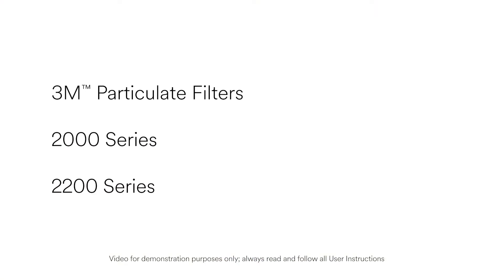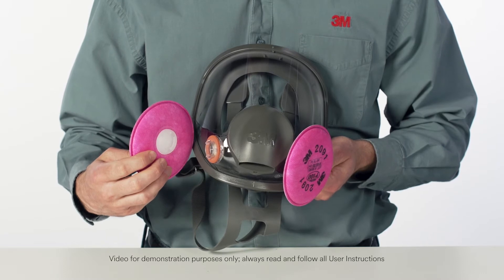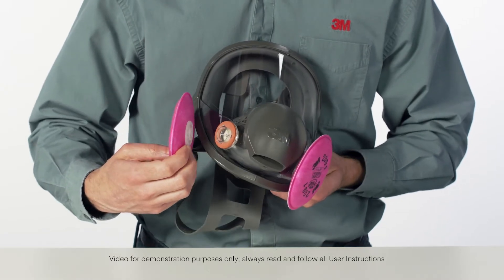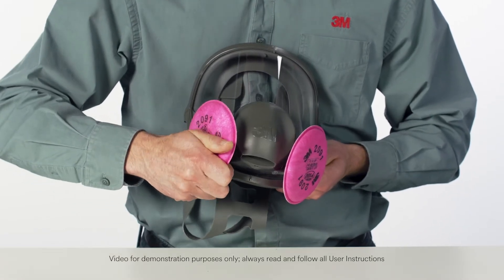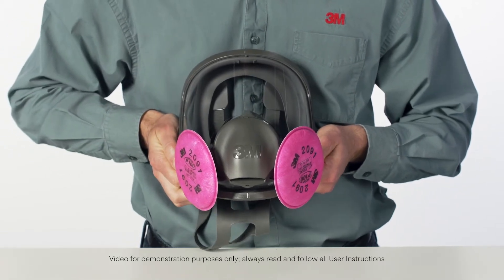To attach the round 3M Particulate Filters 2000 Series and 2200 Series, align the opening on the filter with the facepiece attachment. Push them together and turn the filter clockwise one quarter turn until it stops turning. Do not turn past the stopping point.